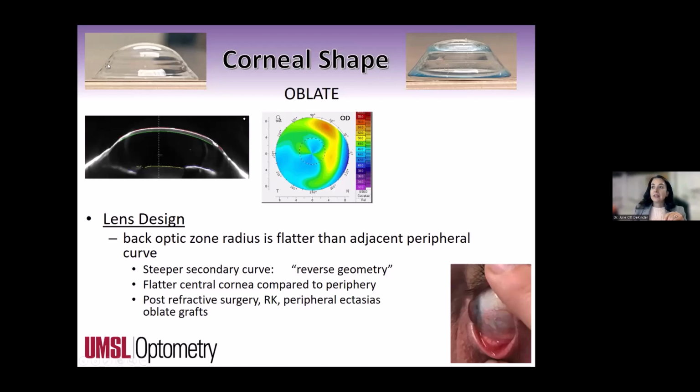And what that gives you is this type of lens here that's a little bit flatter, and you're going to have more space out there at the limbus. And then you can mimic a cornea that looks like this. It looks very oblate, right? So this isn't super prolate. This is definitely oblate. And when you think about a patient that may have gone and had a corneal transplant, a lot of times they have this astigmatism that's like depressed, right? So they have these oblate looking corneas you see on my patient down here. So you have to go with these oblate designs like this.